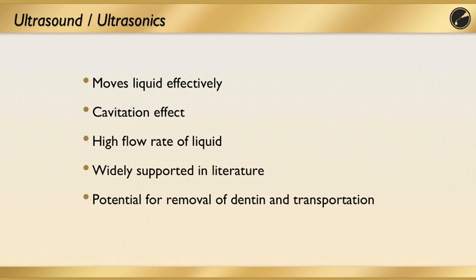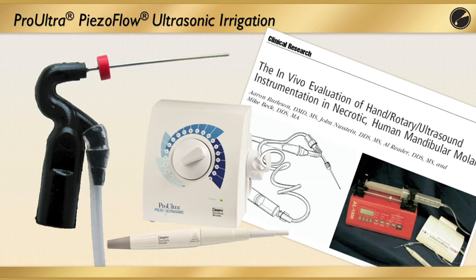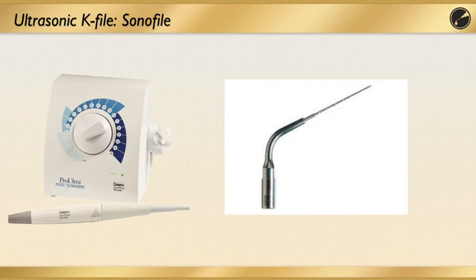The difficulty with this is that sometimes if you use a file, it will remove dentin and cause transportation, as opposed to the EndoActivator. One of the devices you can use for ultrasonic irrigation is the ProUltra PiezoFlow. John Nusstein and several others developed this to be put onto your ProUltra ultrasonic unit. It has solution which flows through the attachment and has a smooth tip which will not cut dentin. Other people use the ultrasonic K-file Sonofile, which also attaches to the ultrasonic unit, but if you use this, it is a file and it will cut dentin. So I would recommend that you never use this in a curved canal.